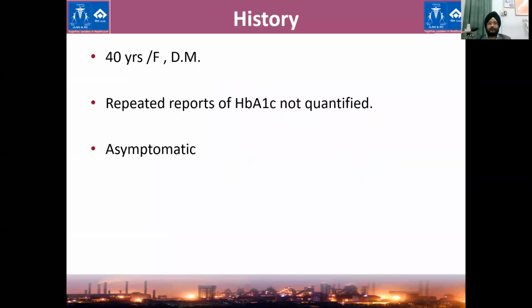Then we went back because we didn't have the history. The patient used to live in one of our mines. The husband worked in a mine. So when we contacted the patient, she said she never had any sickling episodes. She never had any problem related to her hemoglobin. Her only problem was that she was a known diabetic, and every time they used to send a sample for HbA1c, the report came back as HbA1c not quantified because they were using a method of HPLC.